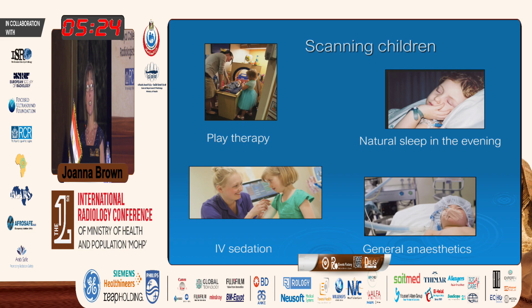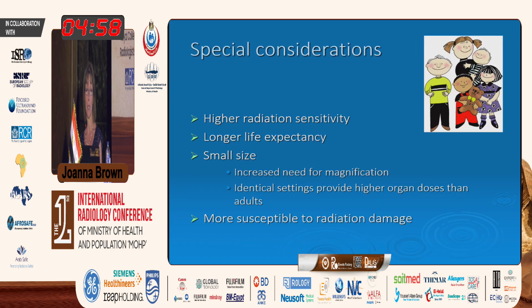We can also give IV sedation if they are very nervous or can't stay still. We can do the scan under general anesthetic, or we have also started scanning children in the evening, about 8, 9, 10 in the evening in the departments, because we try to make them really, really tired and then make them fall asleep, hopefully in our MRI scanner on the table. And why do we worry about this?